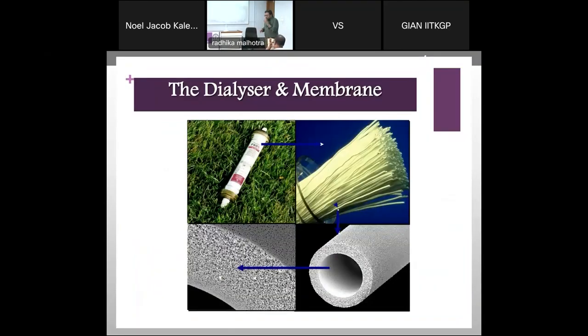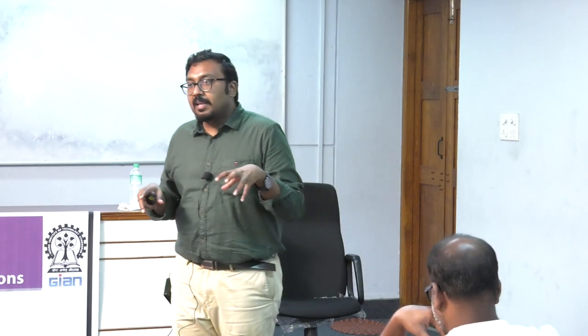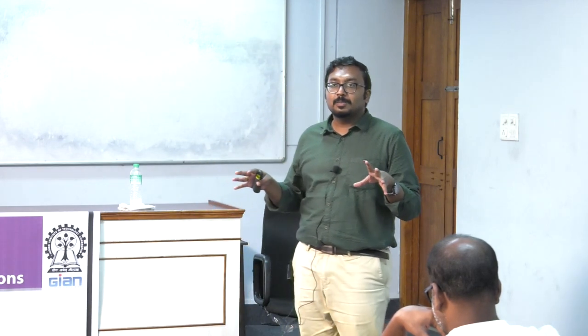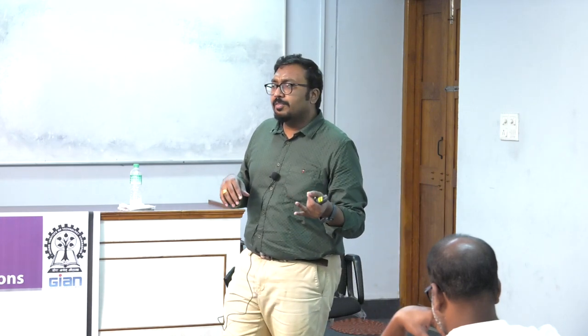Nowadays, all the dialysers, or all the membranes that are used, are hollow fiber membranes, used as a hollow fiber membrane module. It started off with plate and frame or coil type, but today everything in the market is hollow fiber. Okay. And another point why it is important in today's context, at least in India, is that India does not manufacture any hemodialysis membrane. That is the main problem. It is imported either from Japan, the US, or Singapore. These are the three main manufacturers.